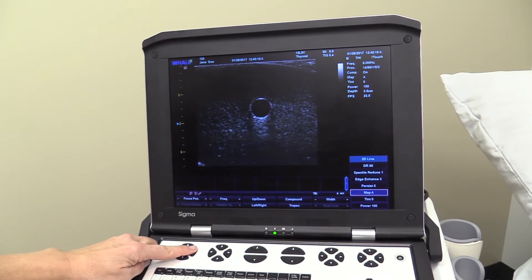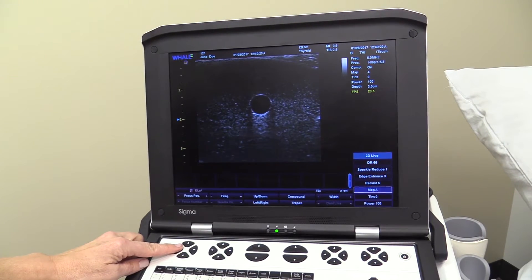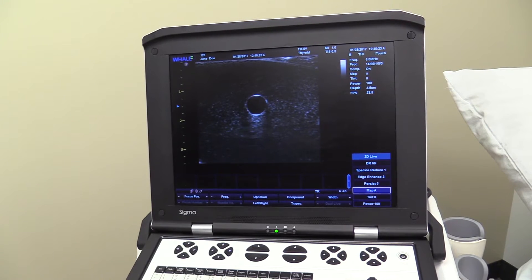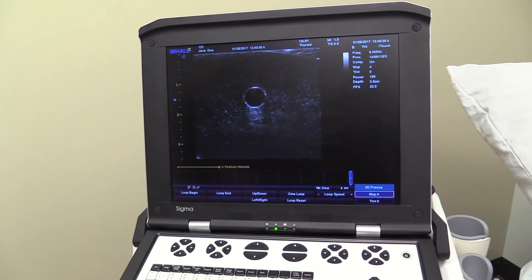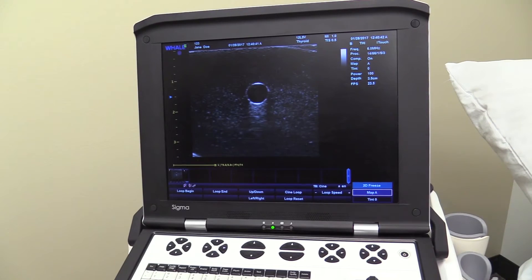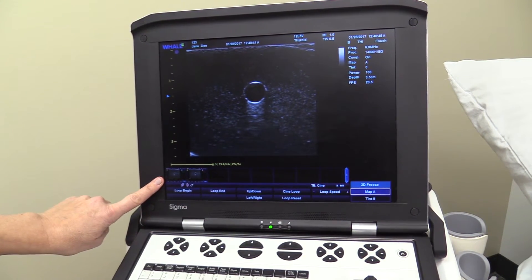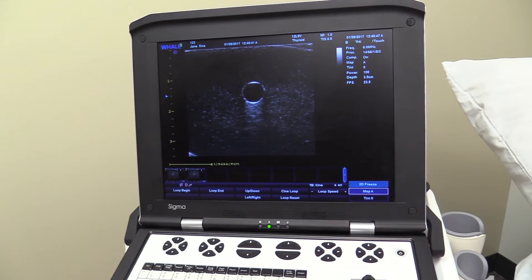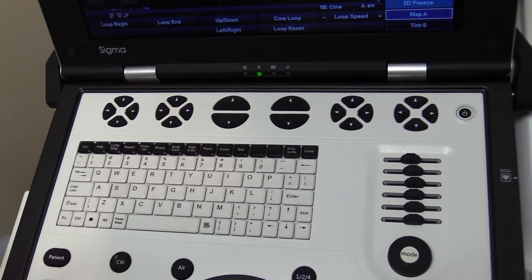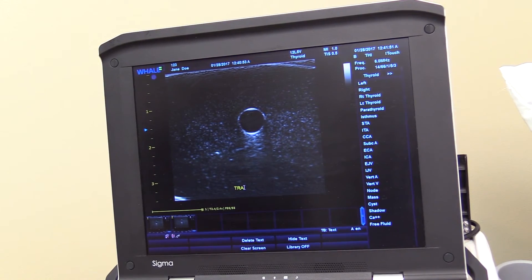Adjusting the focus or area of interest is another status window feature. Obtain a desired image for storage. Freeze the image and store. Stored images will be displayed along the bottom of the screen. To annotate the image, press the text key along the top row of the keyboard.